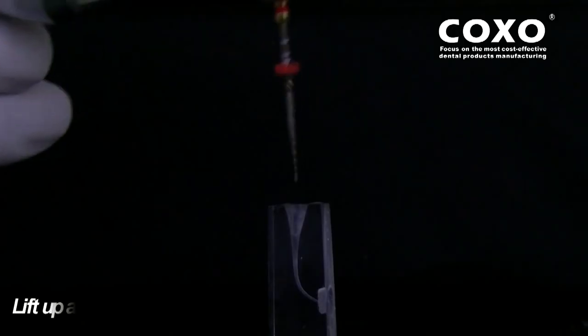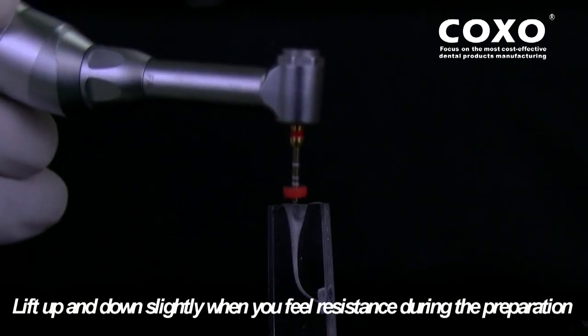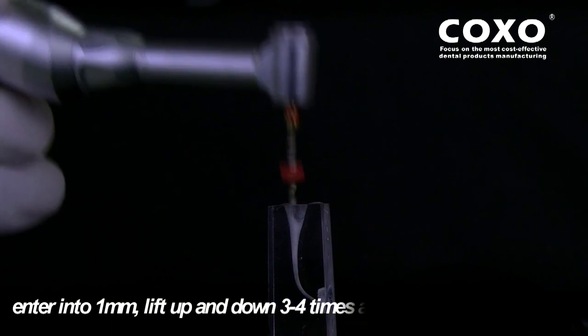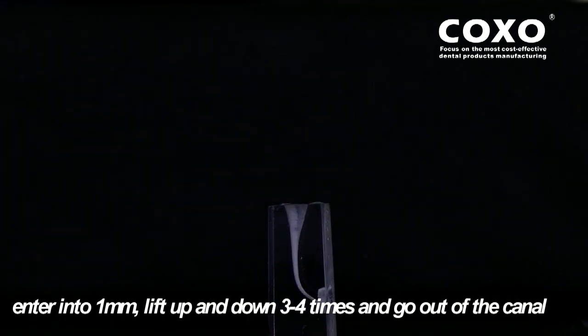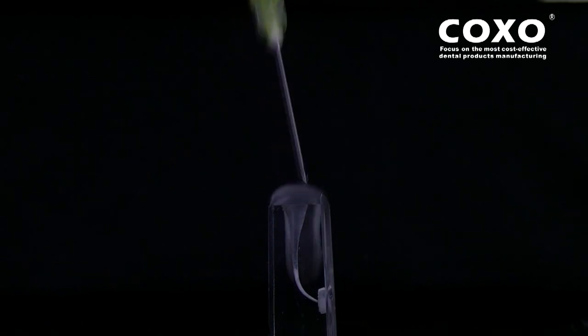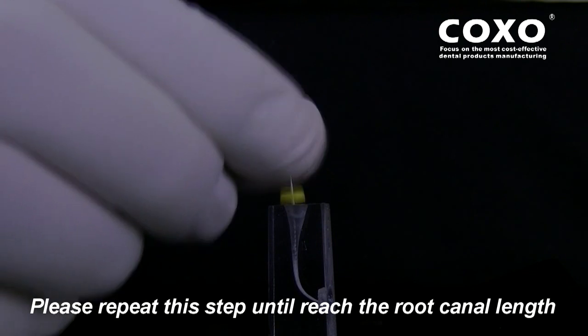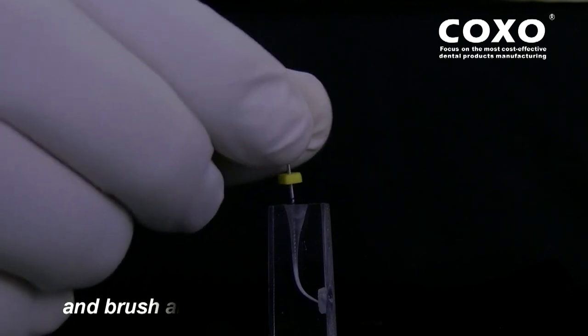SC0425 System File: lift up and down slightly when you feel resistance during the preparation. Enter into 1 mm, lift up and down 3 to 4 times, and go down the canal. Please repeat this step until reaching the root canal working length, and brush around the canal.